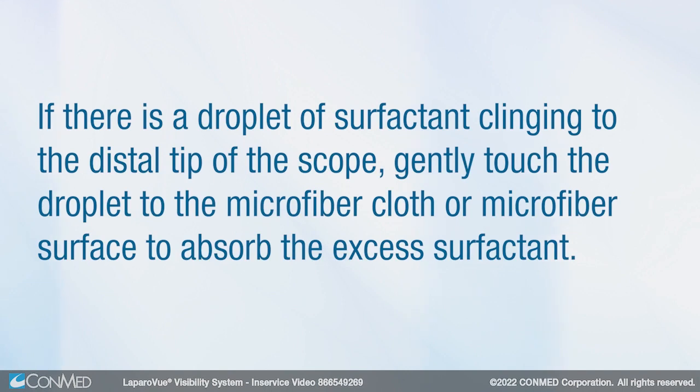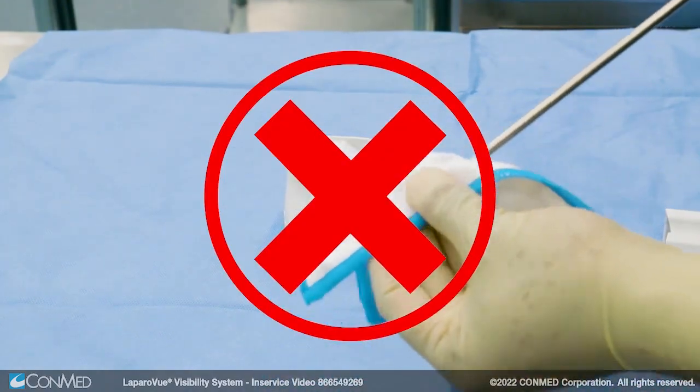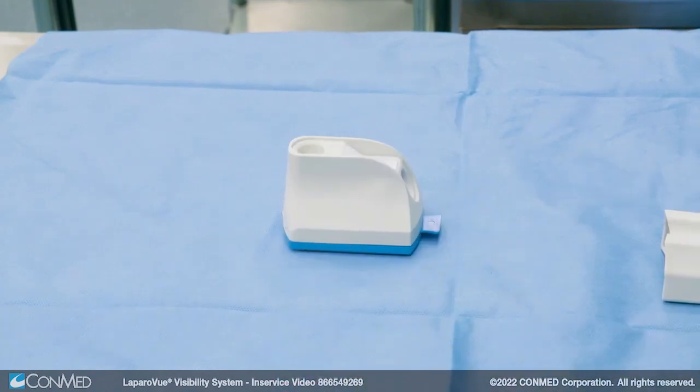If there is a droplet of surfactant clinging to the distal tip of the scope, gently touch the droplet on the microfiber cloth or microfiber surface to absorb the excess surfactant. Do not wipe the scope on either of these materials, as this action will remove the defogging solution that was just added.